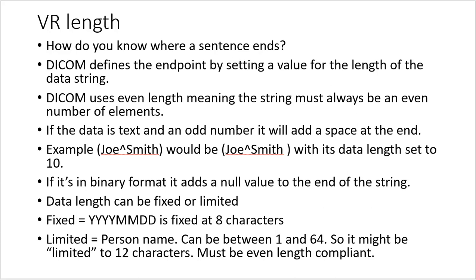Example of a fixed data length is the year, month, day. It's always going to be 8. It's never going to be 7. It's never going to be 6. There's no range. It will always be 8. So it's fixed at 8 characters.